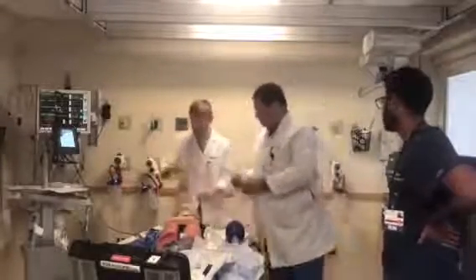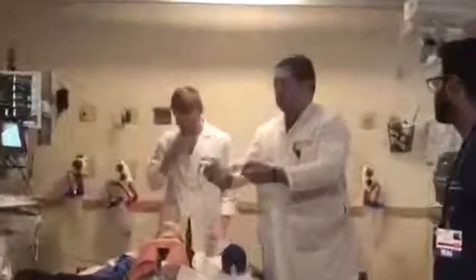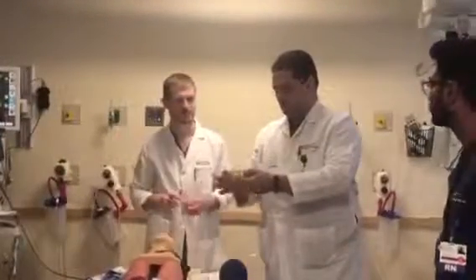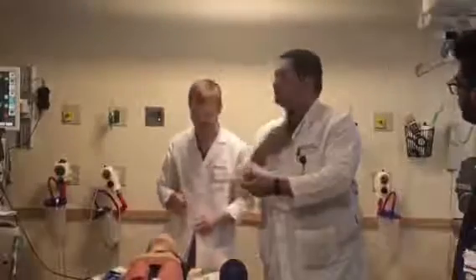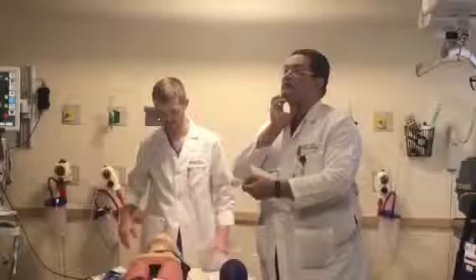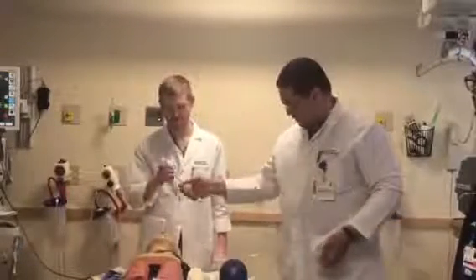So here, just show them 1 second. The combi tube, basically, it usually goes in the esophagus. We inflate this with 20 cc's, we inflate this with 100 cc's. This 20 cc's here will block the esophagus, and this one will block the pharynx up here. And these holes here will ventilate, it's almost like an LMA. So lubricated.